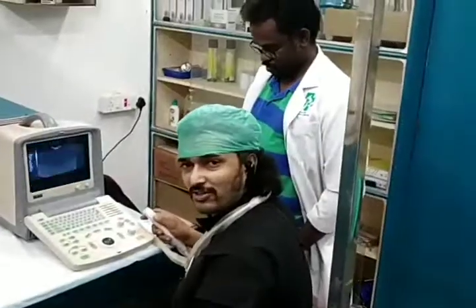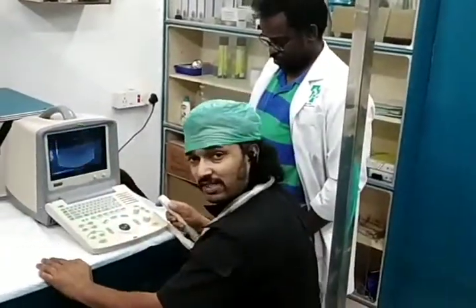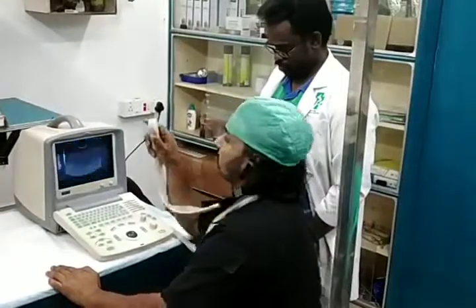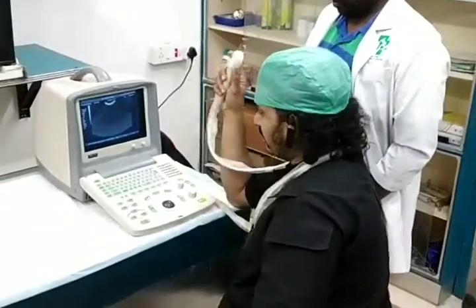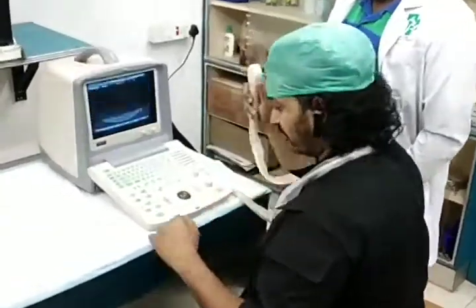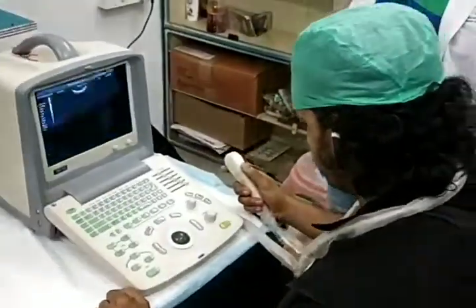Ganesh. We are at the SKS hospital. We have a beautiful ultrasound machine. So this is a convex probe of frequency 6.5 and 9. And let's come closer, let's play with the machine so that we are able to know about it.